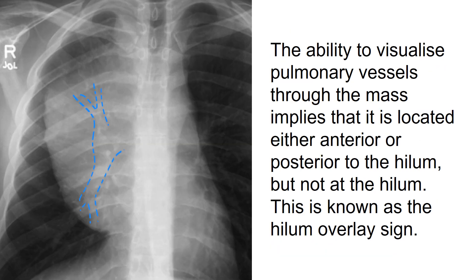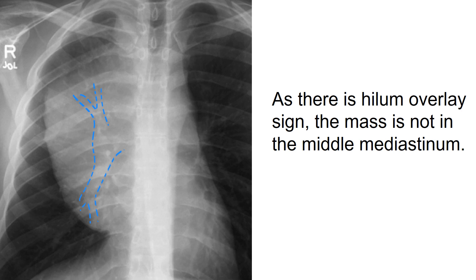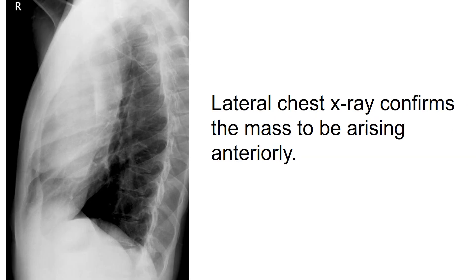The ability to visualize pulmonary vessels through the mass implies that it is located either anterior or posterior to the hilum, but not at the hilum. This is known as the hilum overlay sign. As there is a hilum overlay sign, the mass is not in the middle mediastinum. Lateral chest X-ray confirms the mass to be arising anteriorly.